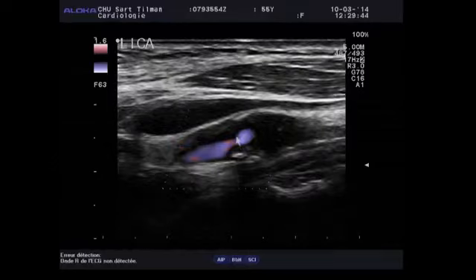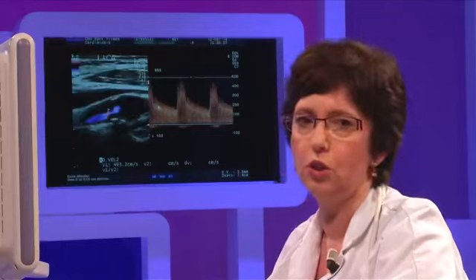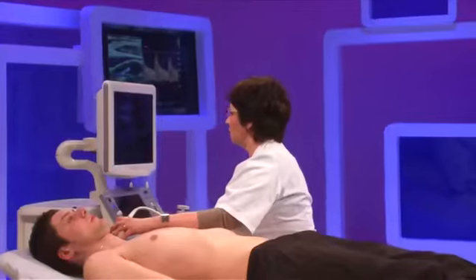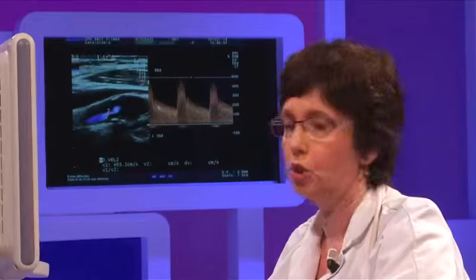Once again, the stenosis. So, of course, we can measure the stenosis, but sometimes the definition is not good. It's too calcified, so you don't see well. Sometimes the stenosis is eccentric too. So there are pitfalls, and the best way to evaluate the stenosis is to use Doppler.